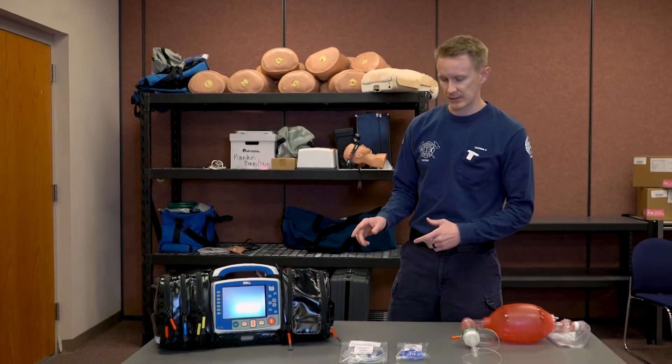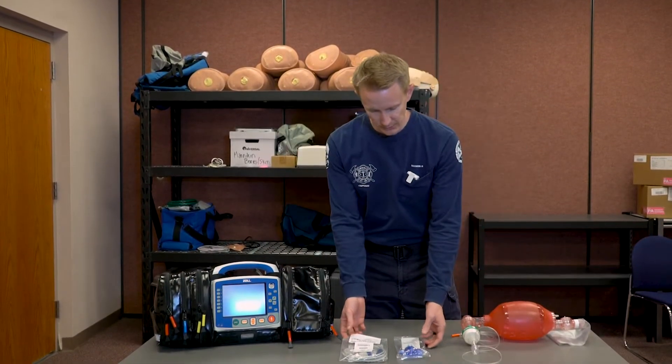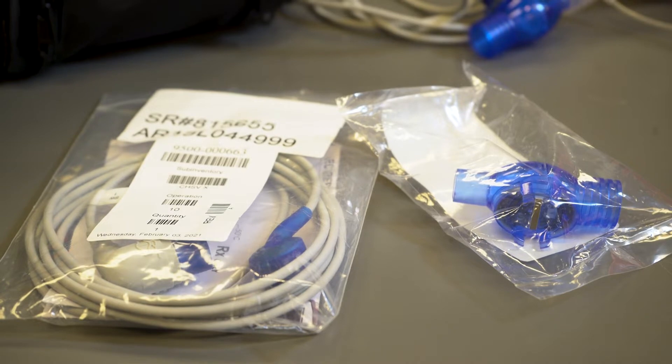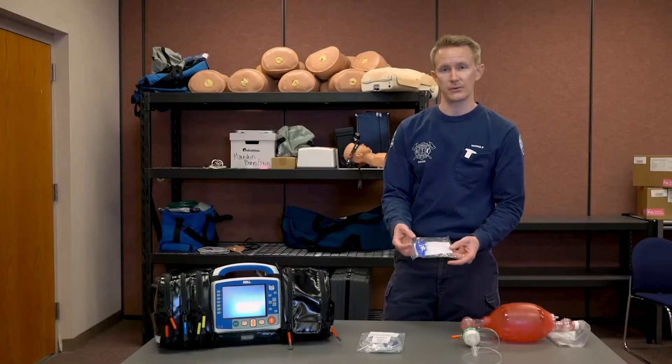To use this technology we're going to need two pieces of equipment: the AccuVent cable that comes with the monitor, as well as the AccuVent flow meter disposable piece, which will have one for each patient use.